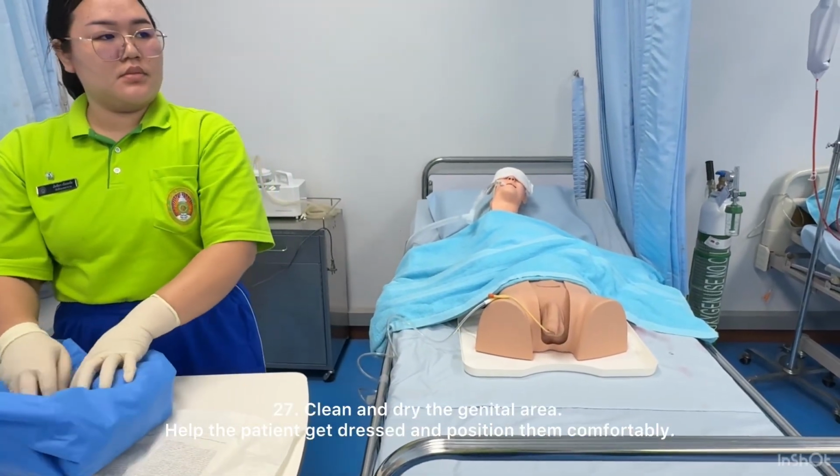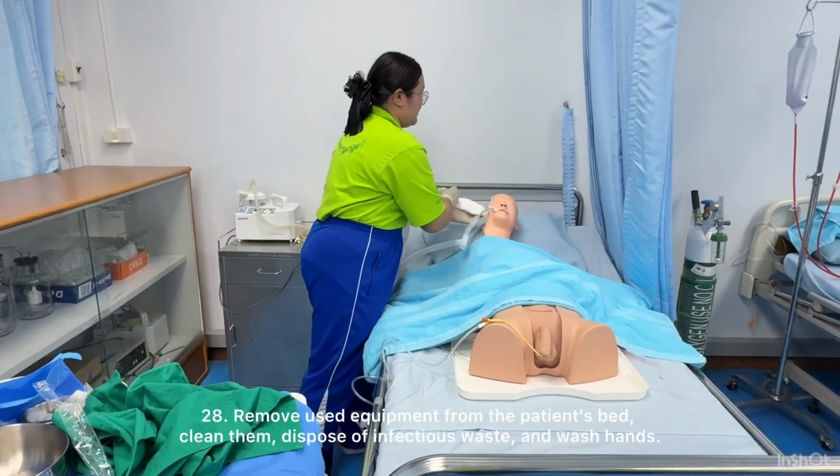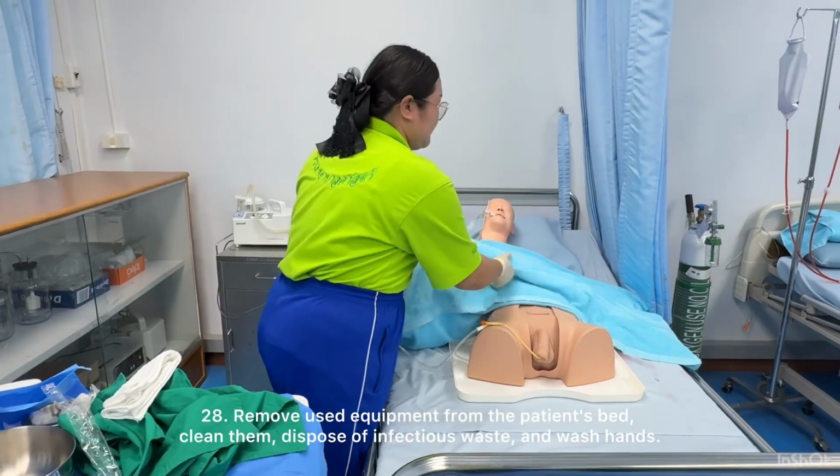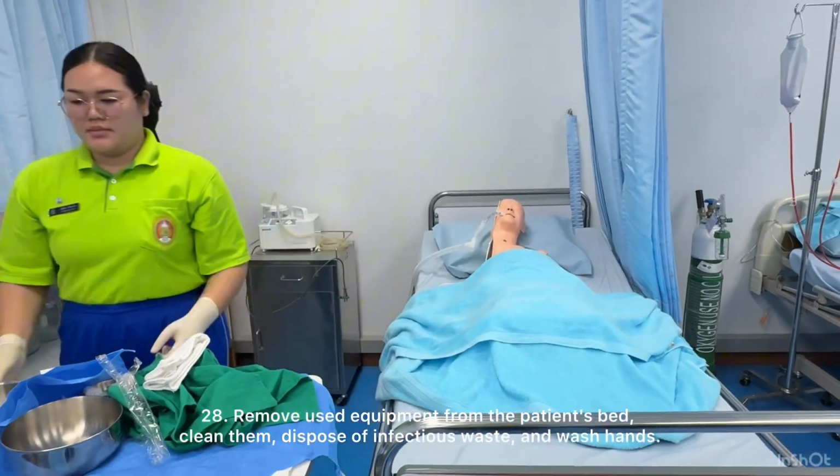27. Clean and dry the genital area. Help the patient get dressed and position them comfortably. 28. Remove used equipment from the patient's bed, clean them, dispose of infectious waste, and wash hands.